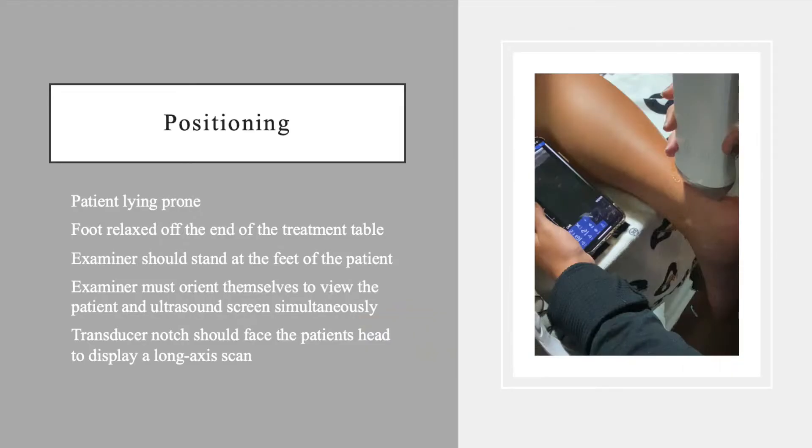The patient should be lying prone with their foot relaxed off the end of a treatment table. The examiner should stand at the patient's feet and orient themselves so they can see the patient and the ultrasound screen simultaneously, as shown here. The transducer notch should be directed towards the patient's head to display a long axis or longitudinal scan of the tendon.